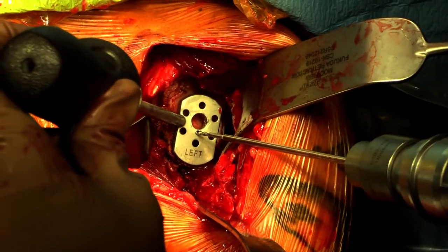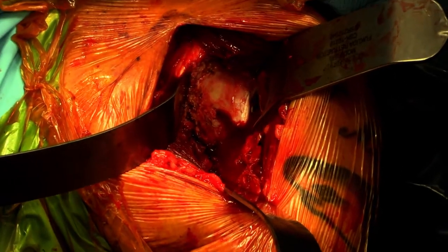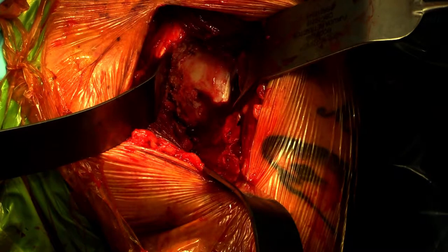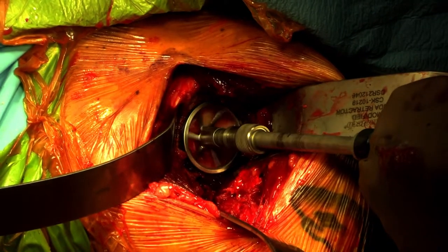Align the drill guide so the inferior rim of the glenoid is in line with the inferior rim of the guide. There is a pilot-tipped and a cannulated option for reaming the glenoid. In this case, we show the pilot-tipped technique. Use the 2 mm drill to drill your pilot hole for reaming. Begin reaming with the starter reamer first. Continue reaming until desired size.